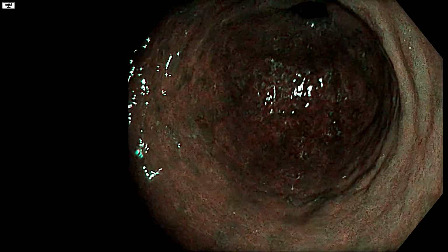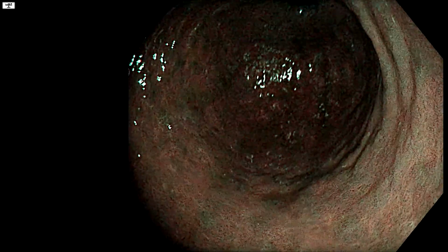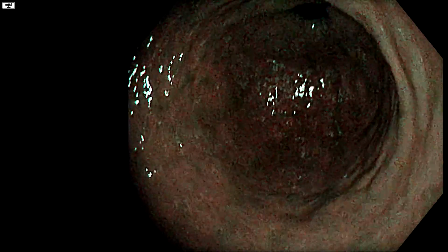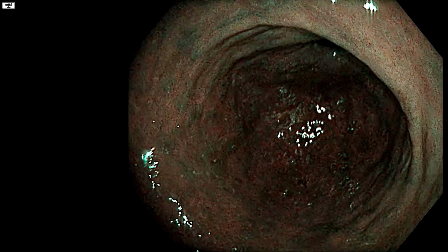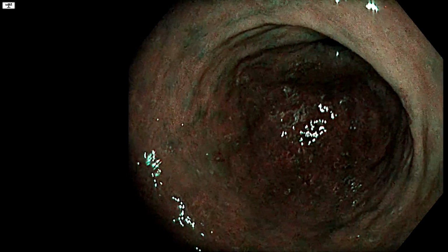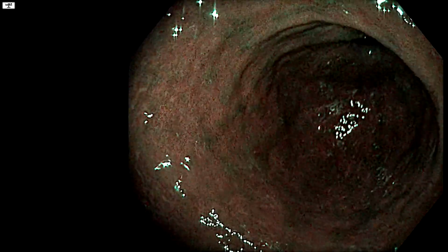Maybe this is a way to educate you on how you can take more focused biopsies and what they should look like. So let's go around this antrum and look for things which could possibly be low-grade dysplasia, and we'll describe them a little bit, not in terms of any complex crests or difficult terminology, but just in terms of what the pattern in the middle of them is. Is it regular, or is it disordered?